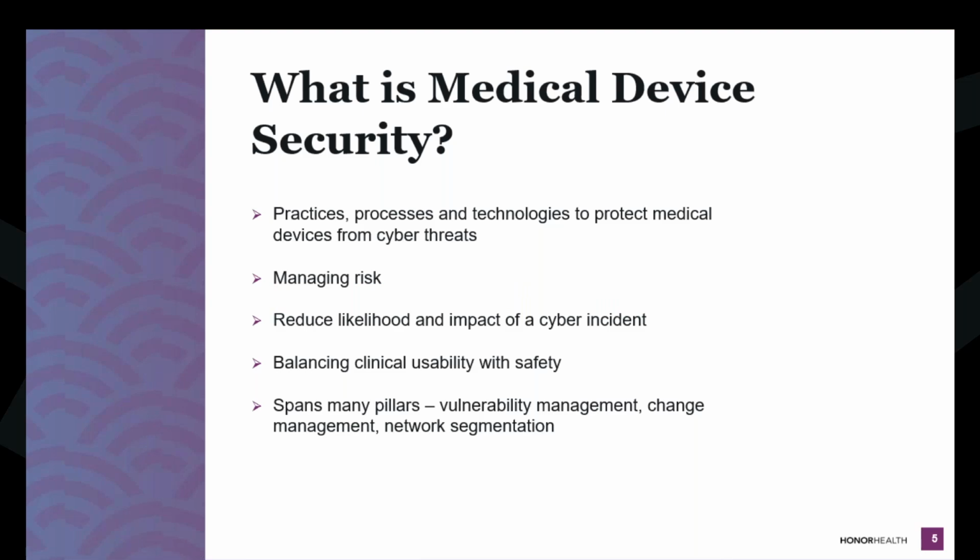Especially with cyber incidents, there have been a lot of breaches just recently, where we get that message from our CISO at 6:30 in the morning saying, how many pieces of equipment do we have and what's connected, really trying to figure out the next steps. Part of that is your asset management, knowing what equipment you have and what talks to what. This is all part of your medical device security program.